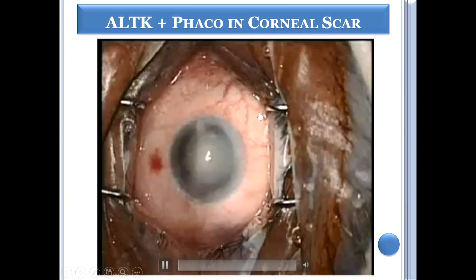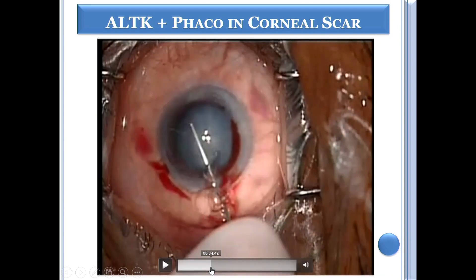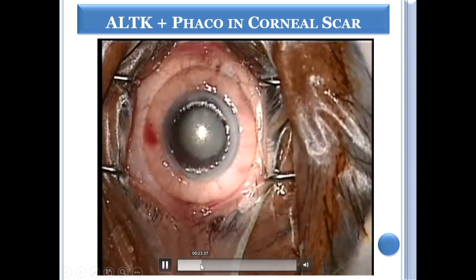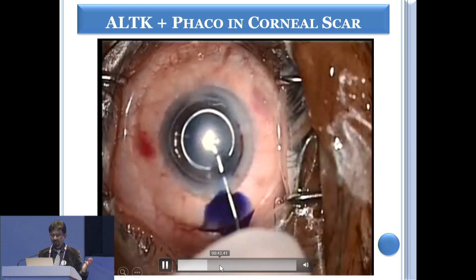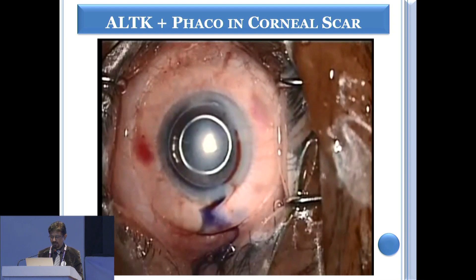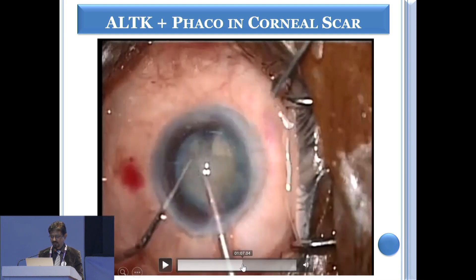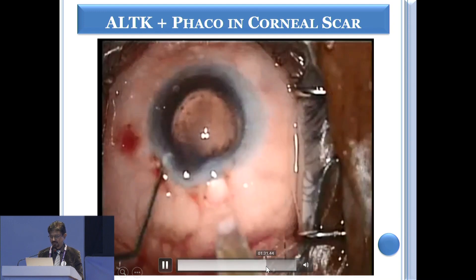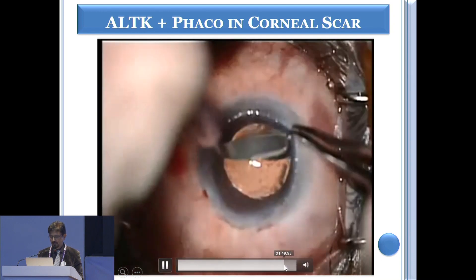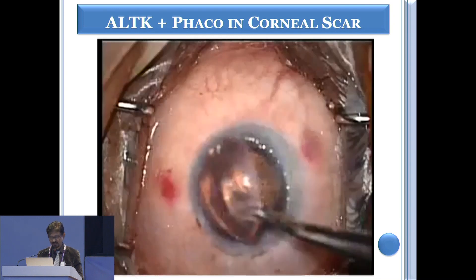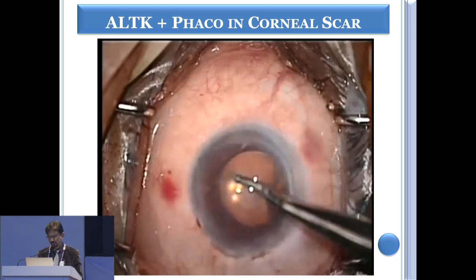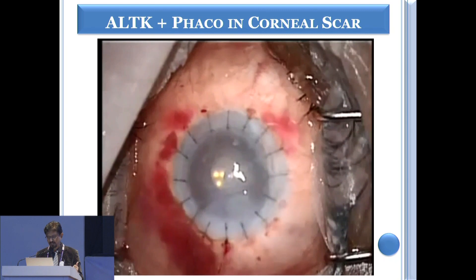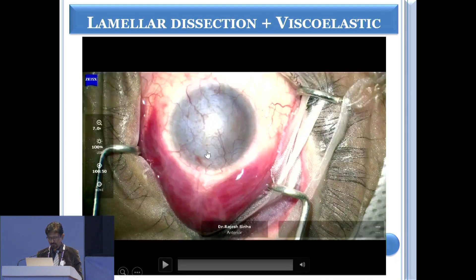If you have an opacity which is covering the cornea significantly, you can do an anterior lamellar keratoplasty. Once you cut and remove the superficial hazy cornea, you can see how clear it is, and once the cornea clears up, you can complete the cataract procedure. Once the cataract procedure is complete, you place the intraocular lens, and then put a donor lenticule and suture it. If the opacity extends only up to about 150–200 microns, you can do a sutureless anterior lamellar keratoplasty, but if the opacity is deeper, you have to put a suture.